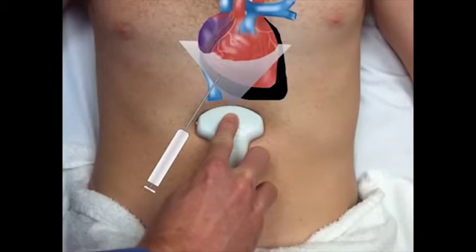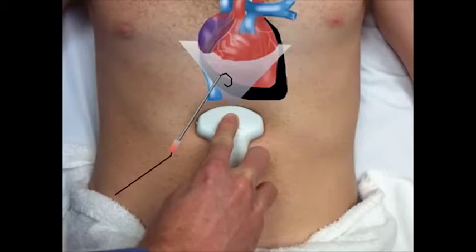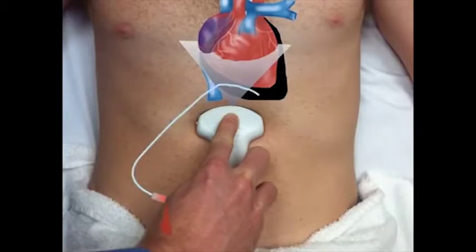As I insert the needle and draw back, I'll get a flash of blood into the syringe. Once I've seen this blood, I'm going to confirm that it appears my needle tip is in my pericardium. After I do that, I'll take the syringe off, and I'll place a wire through the needle into the pericardial sac, again confirming that the wire is in the pericardial sac and not the ventricle. I'll use ultrasound for this confirmation. Then I'll slide a dilator over the wire, and finally pass a catheter over the wire and remove the wire. At this point, I can connect the catheter to a drain to drain the pericardial effusion.